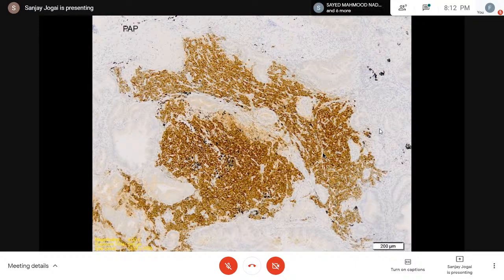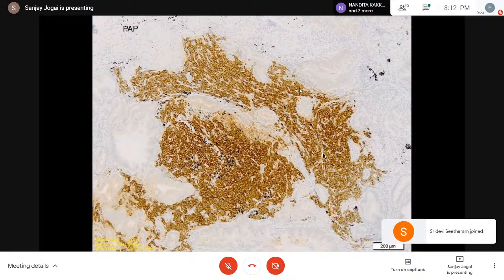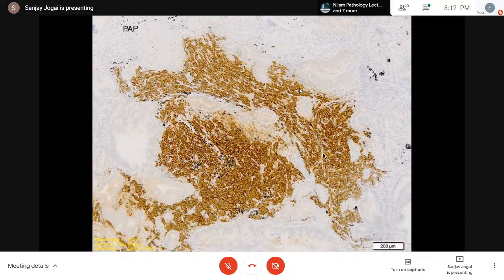Yeah. Thank you. I have a comment to make, Sanjay. This tumor in tumor metastasis, we had a case in which a person came with a meningioma, and when I saw the case, I didn't know the background history, and I said there was an RCC metastasizing into the meningioma. There was PAX8 positive meningioma, a nice meningioma which was EMA positive, and then later on the history was that this patient had RCC 15 years ago and was operated, nephrectomy. So these things do happen.